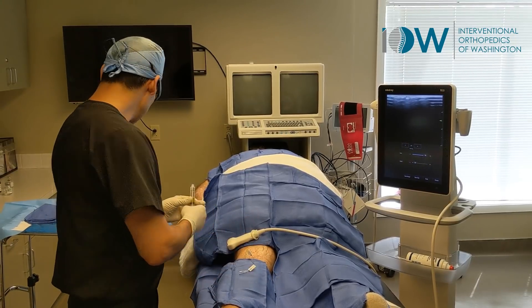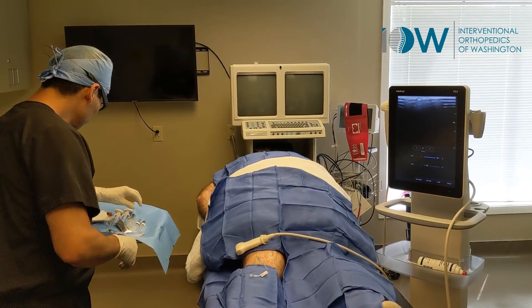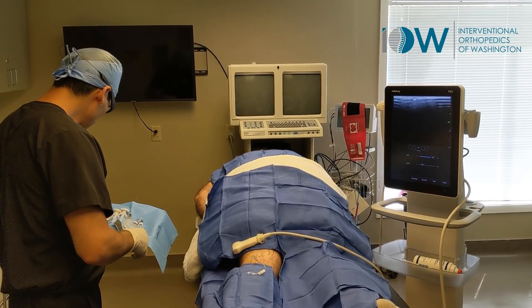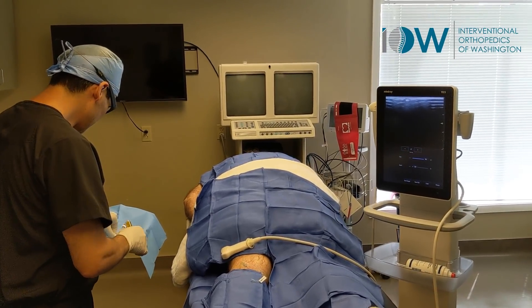Got some fluid here that we're gonna toss out and follow with a little treatment into the capsule.